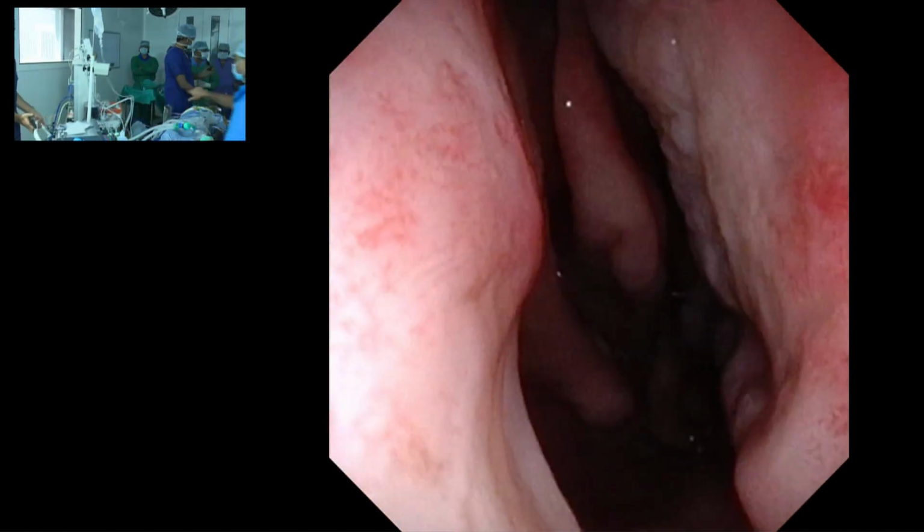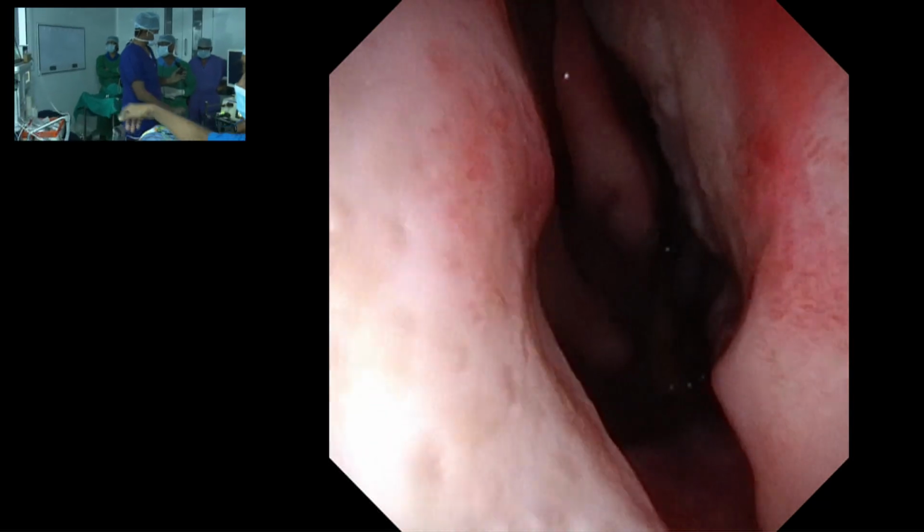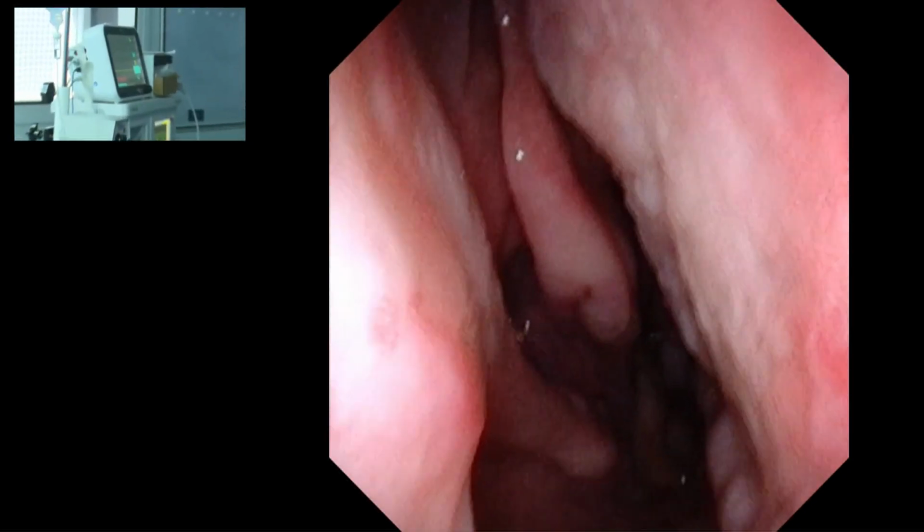Is it clear? Very clear. And Vijay, just for the beginners, you are not using any local anesthesia. We have packed the nose with xylocaine jelly soaked gauze piece, and we have removed it. And the patient already had turbinoplasty, so a lot of space is there.